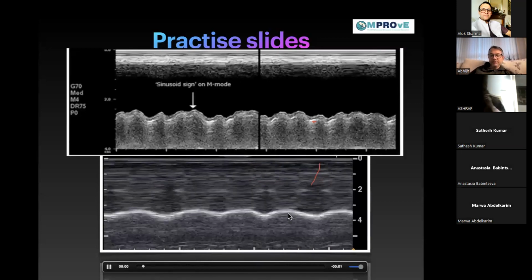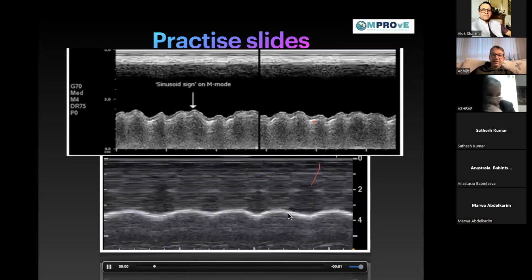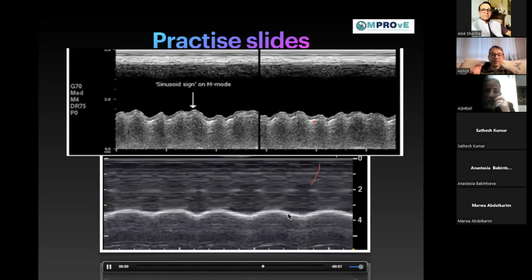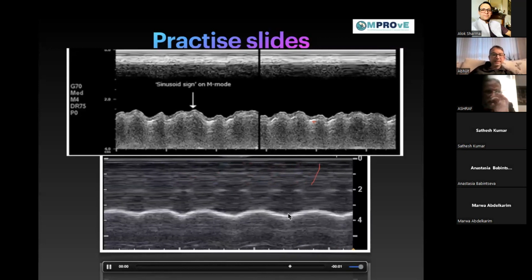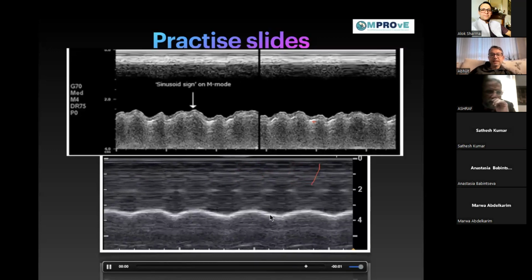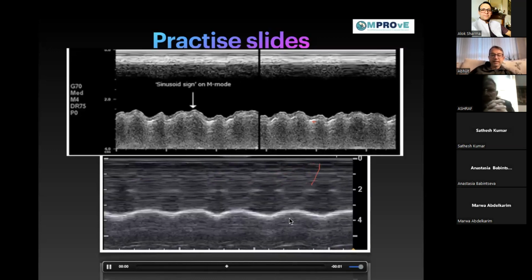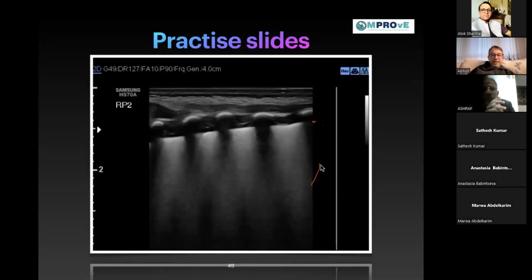But we're not going to cover the diaphragmatic excursion here, that's a completely different topic, to decide how the lung is behaving and whether the baby is ready for extubation and all that. But you see the difference in how the pleural effusion and the diaphragmatic excursion look. Okay. Well done, guys. Okay, next one.